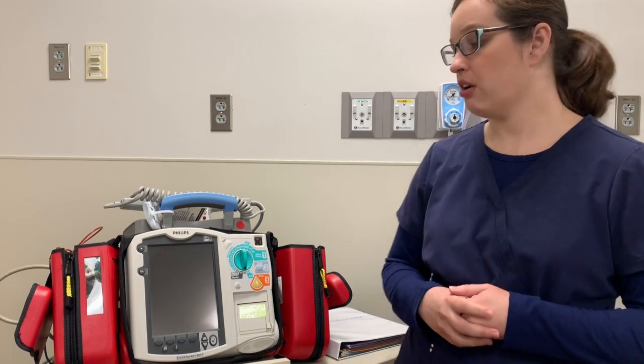Hi, welcome to the Philips MRX defibrillator skills ambassador video. I'm going to review the defibrillator with you as well as all of the equipment that you would need to make it work during a code situation.